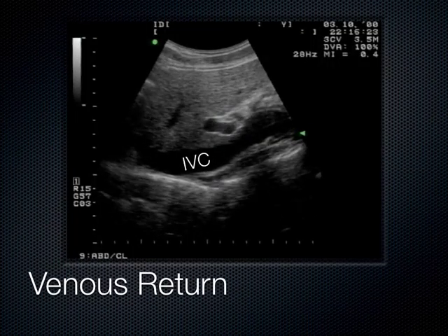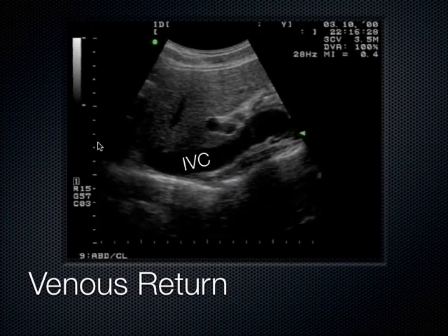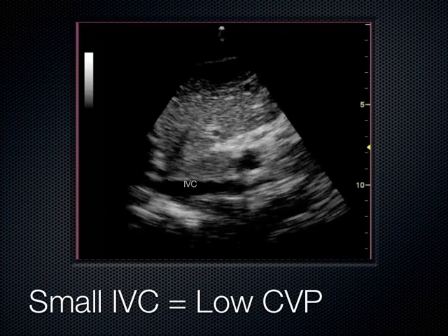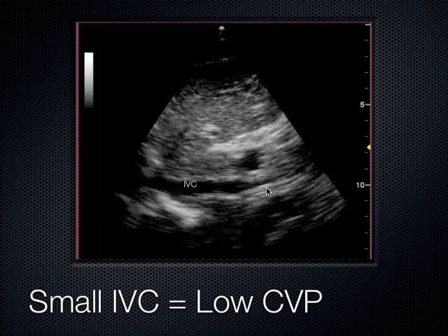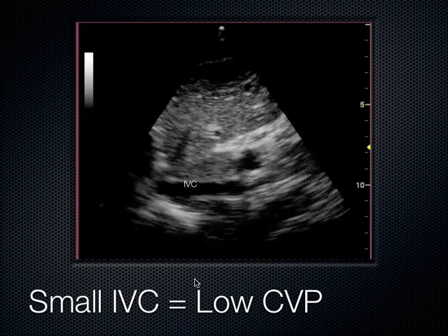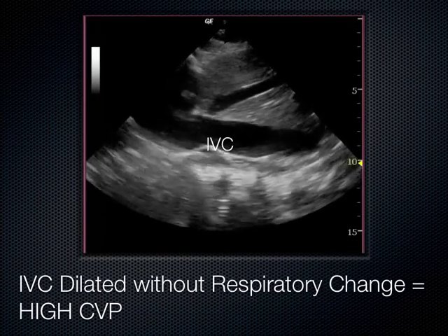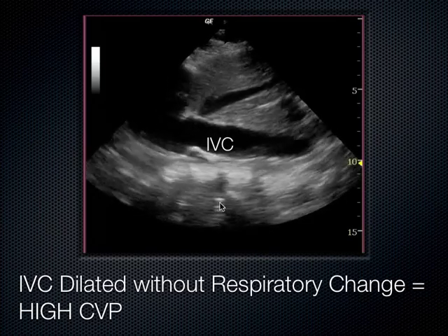This is what it looks like. Breathing in and out, there's absolutely no change of their IVC. If I look over here at these calipers, maybe it's about 1.5 or 2 centimeters. I'm not dropping calipers here, I'm just demonstrating that. Here's one that's a really small IVC that, as they breathe in, collapses down. We can see this collapsibility going on. As they breathe in, it just completely obliterates. So that's a really low CVP. This is somebody where I'm opening up the IV fluids. Another example here of a dilated IVC, no respiratory change, high central venous pressure.